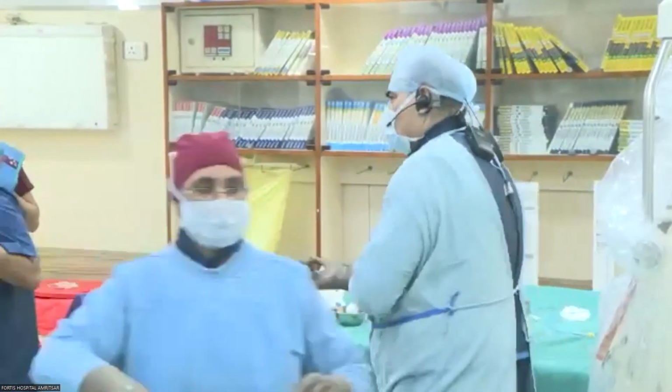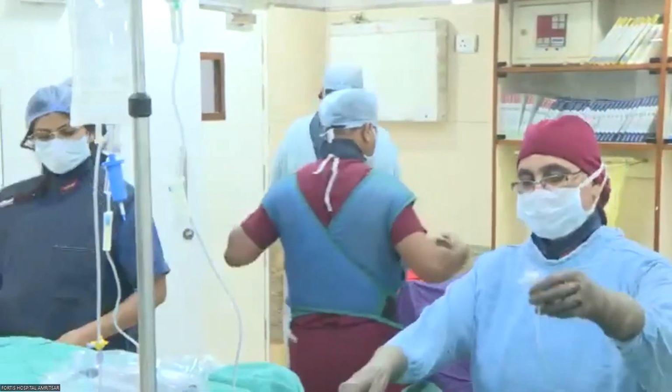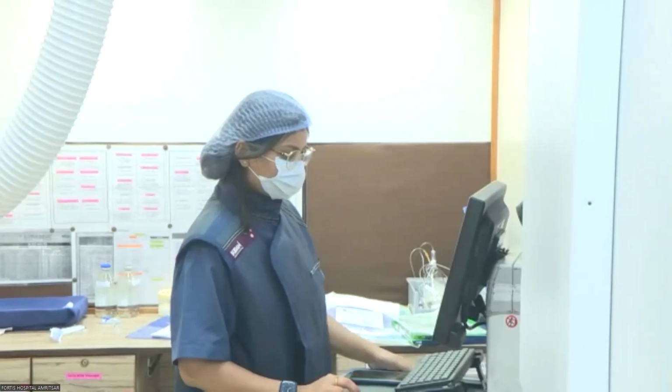And actually, Ramesh should answer. Manish asked a question to you. Anil Putta, he asked a question. You have to answer the question. He asked why some people are doing an opening of the strut and some diagonal, he opened up the strut.